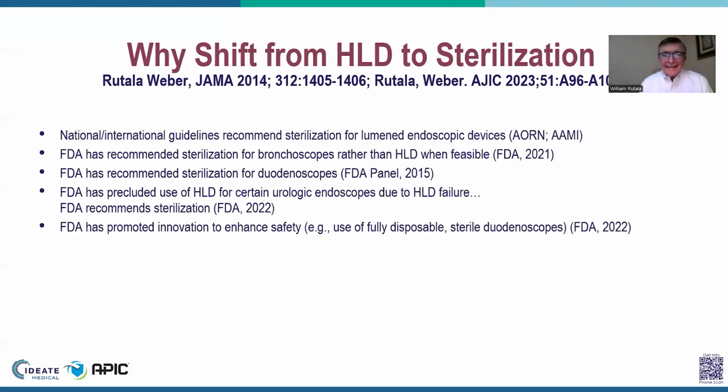And an FDA guidance document, or more precisely, safety communication in 2022, they said that you should not perform high-level disinfection for certain urologic endoscopes due to the failure of high-level disinfection, and they recommended sterilization. And they said if you could not do sterilization of these certain urologic instruments, you need to eliminate the use of these urologic instruments because high-level disinfection is not acceptable. And lastly, you can see FDA has promoted innovation to enhance safety. They've talked about in safety communications the use of fully disposable sterile duodenoscopes.